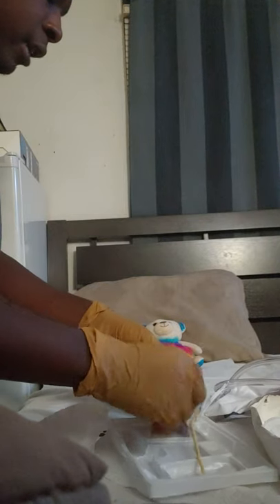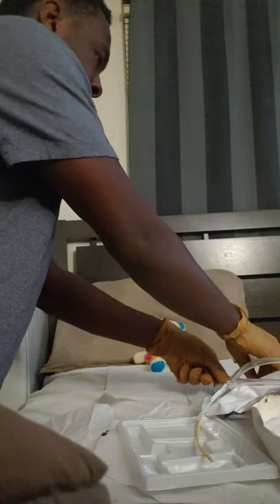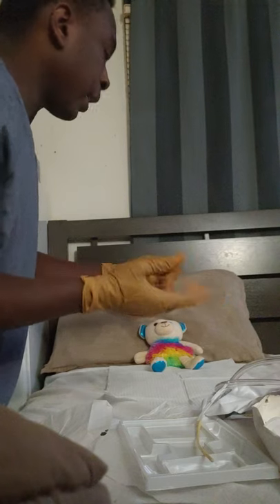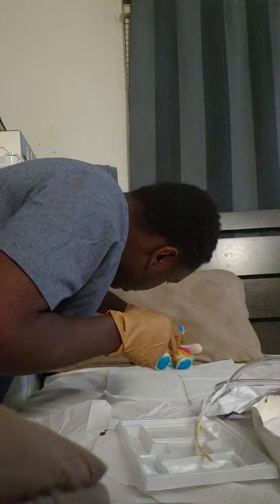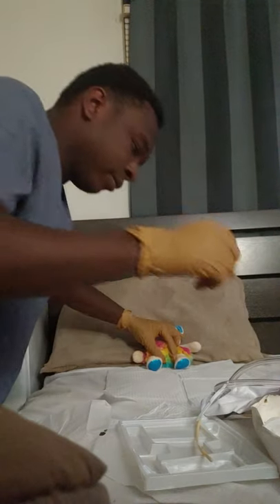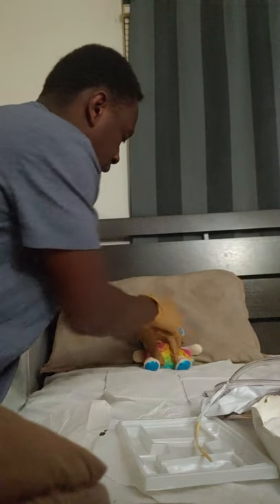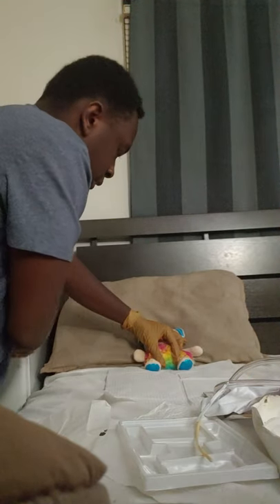Now I'm about to clean my patient with the betadine — my betadine is right here. I'm going to open it and have it ready. Once I spread the meatus, I can't leave my hand. Spread the meatus. Take my betadine: one — left side meatus, discard; two — right side meatus, discard; middle meatus, discard.